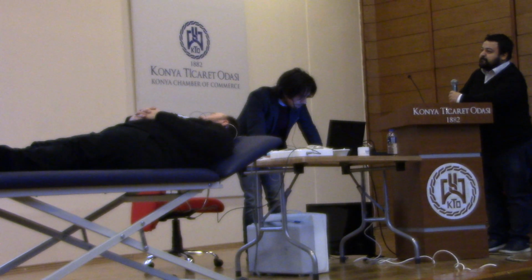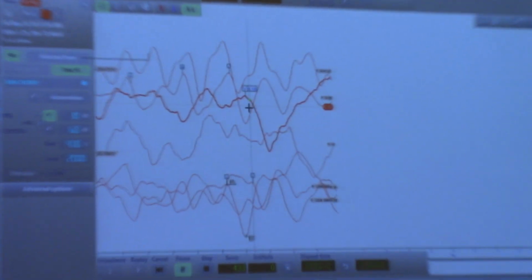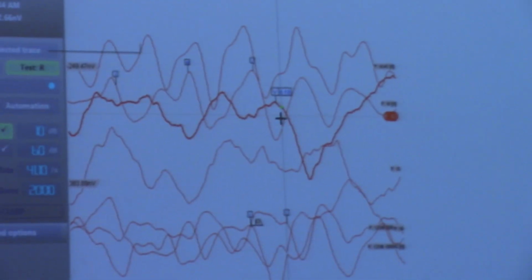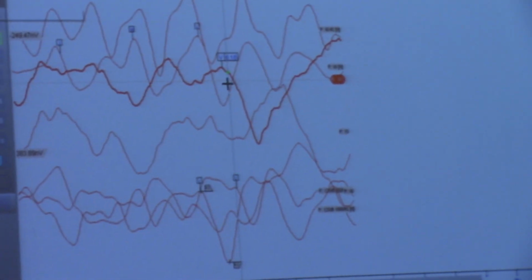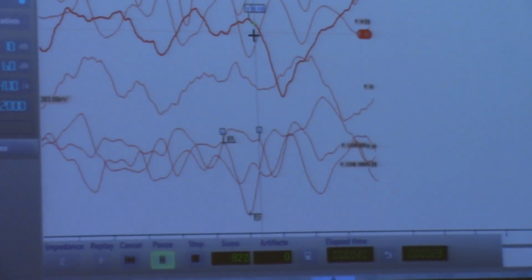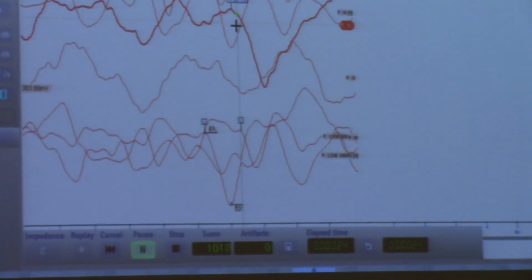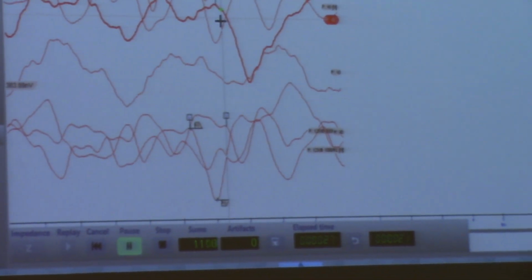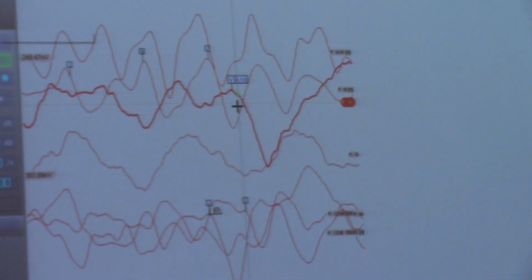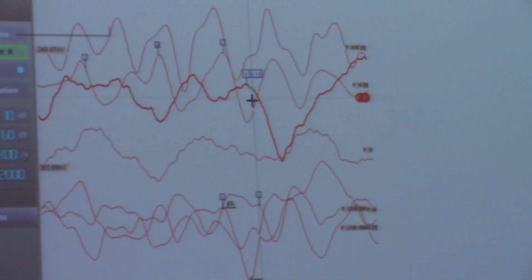Yes, you can see here in the evidence you have a 40 dB chirp, and you can see that still it is as big as 90 dB that we tested before. Now I'm running 10 dB and it disappeared.